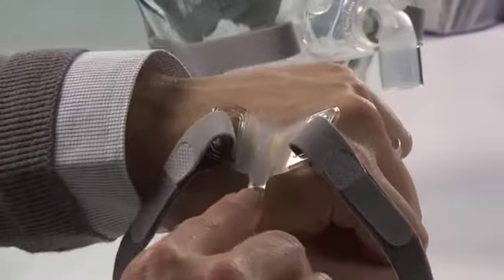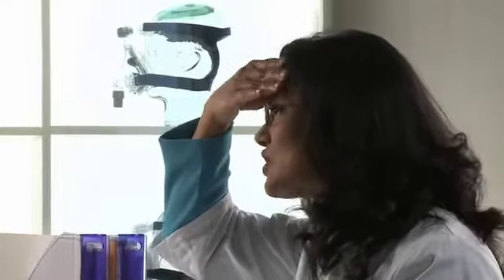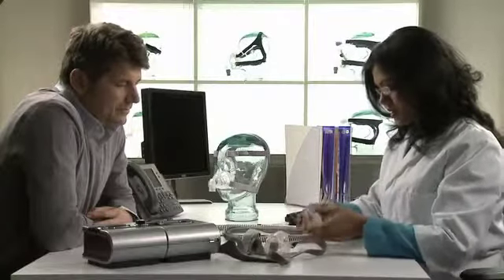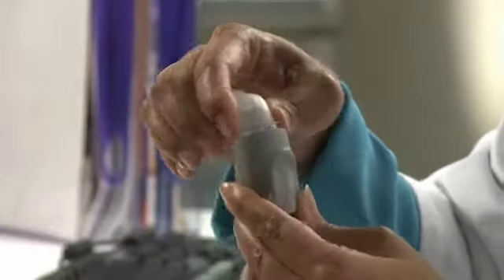It really is that simple. Before fitting the mask, remove the elbow by pressing the side tabs and pulling away from the mask. Connect the elbow to the device's air tubing.